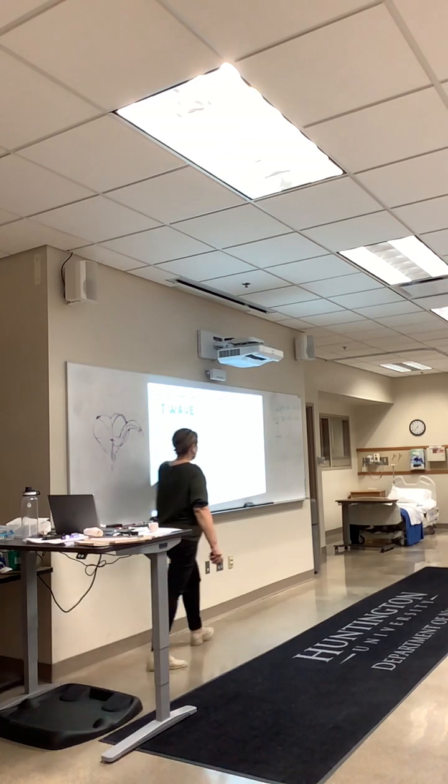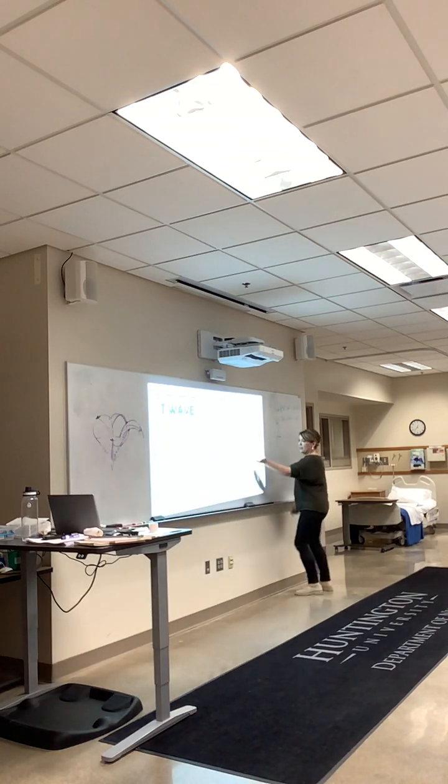So, T wave, you know, it's the recovery. Okay, we don't measure it. We measure the QT interval, but we don't measure just the T wave.